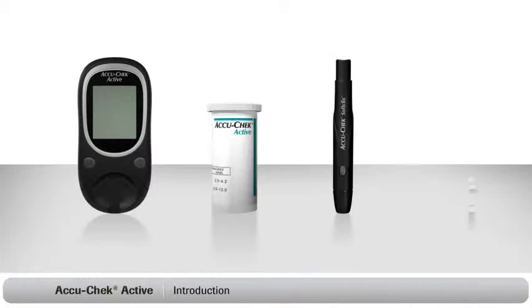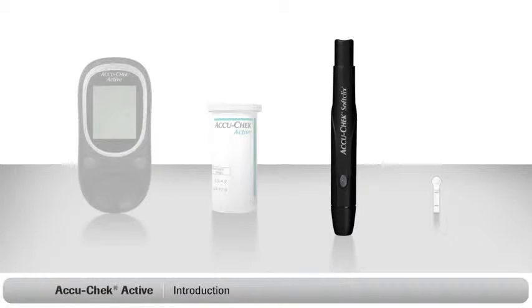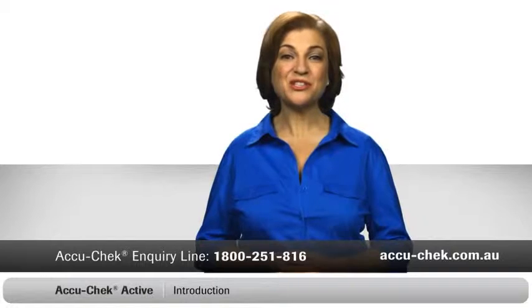Now, the first thing to do is make sure that you have everything you need to start monitoring. You should have the following items: an Accu Chek active meter, a container of Accu Chek active test strips, an Accu Chek soft clicks lancing device, and an Accu Chek soft clicks lancet. If you can't find something or need assistance with any of the steps that follow, just call the Accu Chek inquiry line.